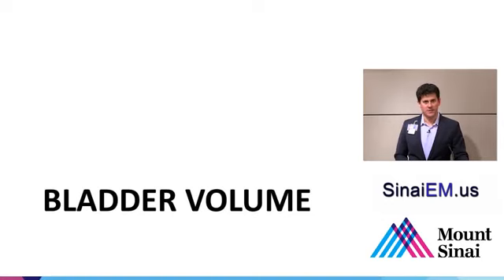We can get a rough sense of bladder volume if your question is just, does the bladder look big or small? So someone who tells you that they haven't been able to urinate for 12 hours and you look at their bladder and it looks gigantic, well, then they have an obstruction. And if they have no urine in their bladder or you can't find their bladder, then they're anuric for some reason. So that's a pretty big decision point right there.